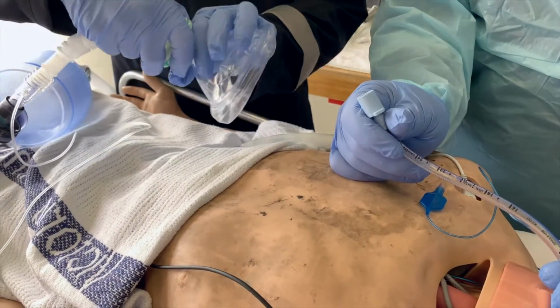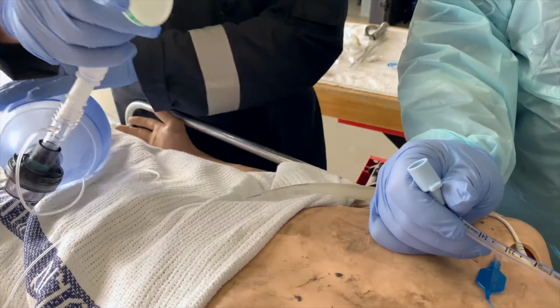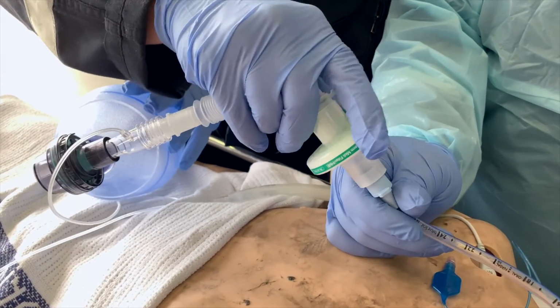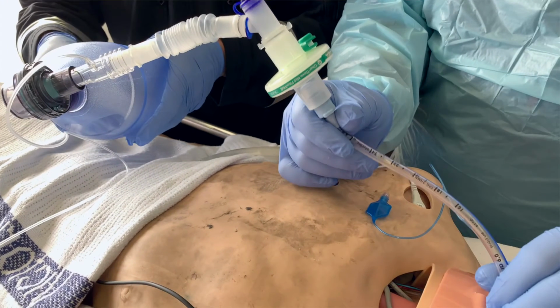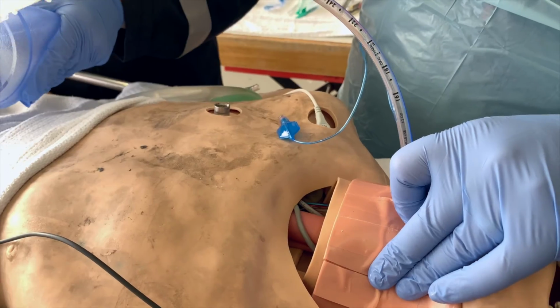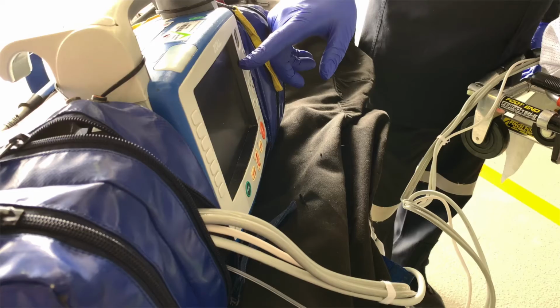While the lead clinician maintains a grip on the ETT, the assistant immediately attaches the BVM and capnography, initially performing gentle inflations until ETT placement is confirmed. Resistance to ventilation may suggest extratracheal placement has occurred. Verify tracheal placement by capnography waveform.